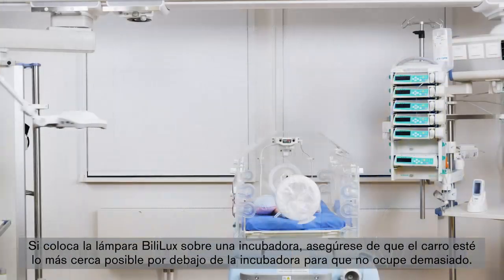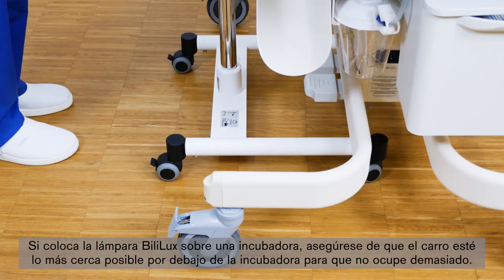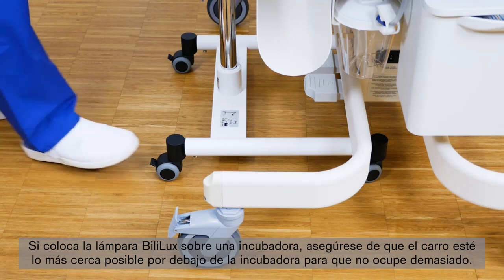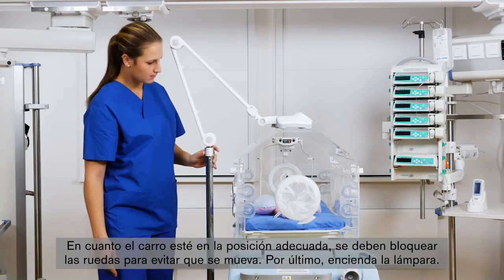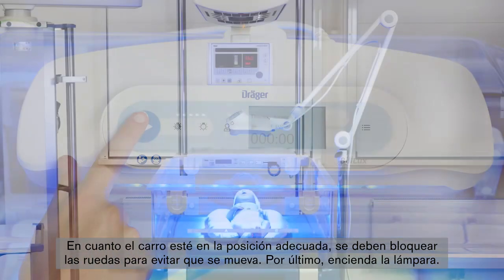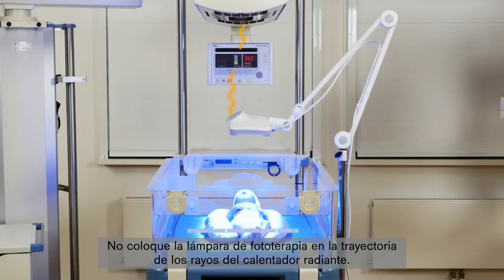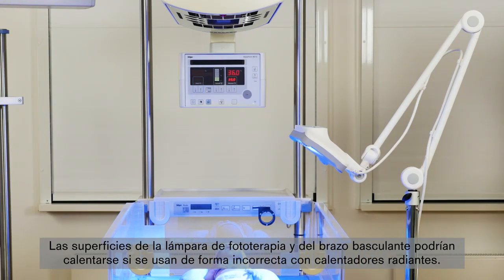If you position the Bililux above an incubator, make sure that you position the trolley as close as possible below the incubator to have a small footprint. As soon as the trolley is in the right position, the casters have to be locked to prevent movement. Finally, switch on the light. Do not position the phototherapy light directly in the path of heat rays from the radiant warmer. The baby should still receive radiant heat, but also phototherapy light. The surfaces of the phototherapy light and the spring arm may become hot when used incorrectly with radiant warmers.